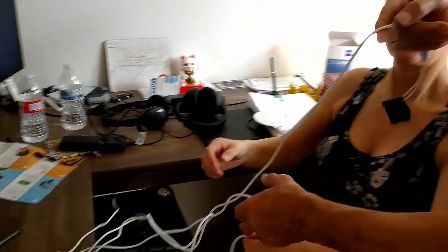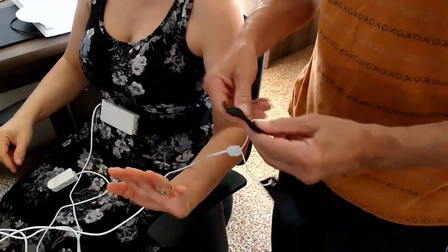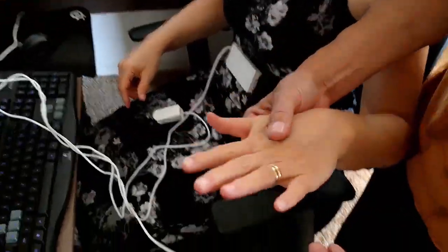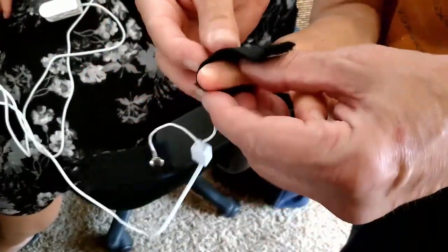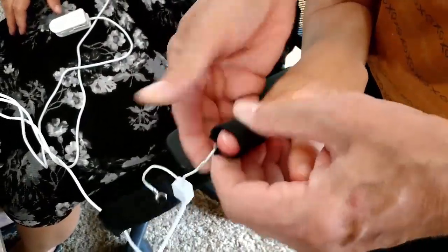Now, can I see your left hand? Yes. Okay, and on her left hand, we're going to do the two galvanic skin responses here. And so I'm going to take her lovely hand, and her lovely index finger and middle finger. I'm going to put this around her index finger like this, nice and tight.